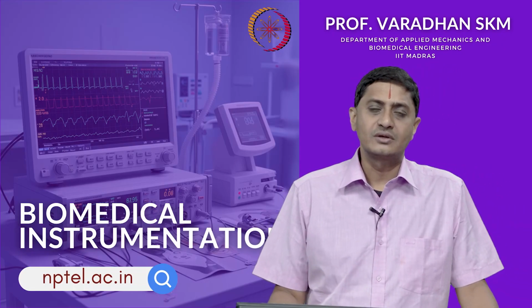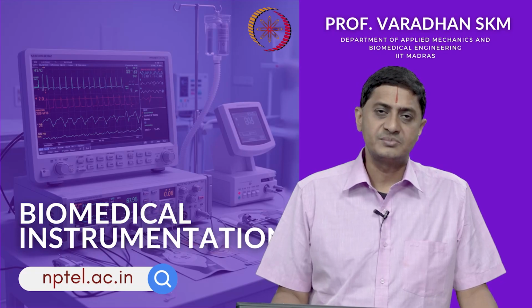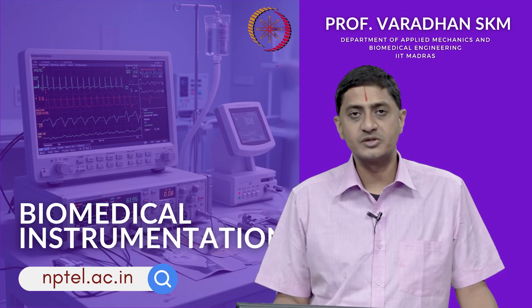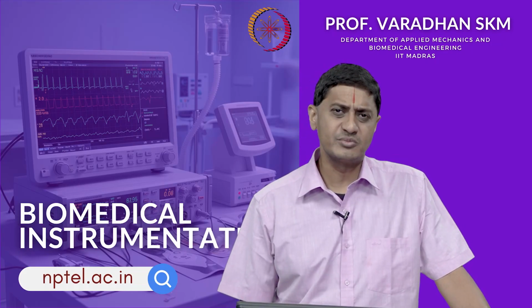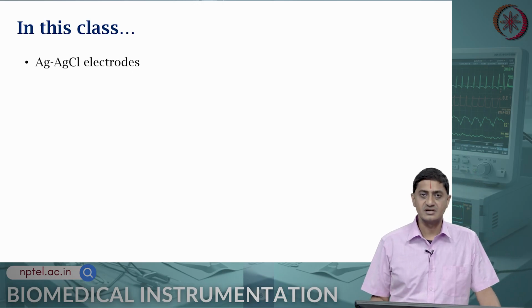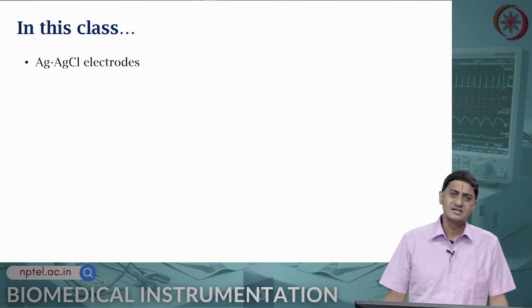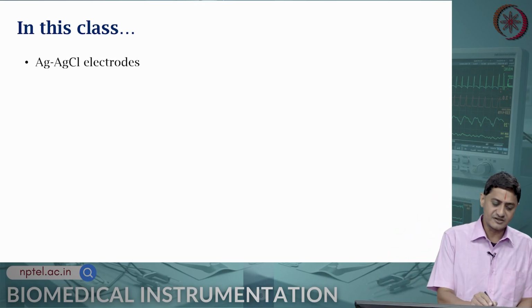We have been looking at biopotential electrodes. In the previous set of videos, we looked at polarizable and non-polarizable electrodes and gave some examples. What is an example of a nearly perfectly polarizable electrode? That is the platinum electrode, in which all or almost all the current is the capacitive or displacement current. The other case is a nearly perfectly non-polarizable electrode, which is the silver chloride electrode.